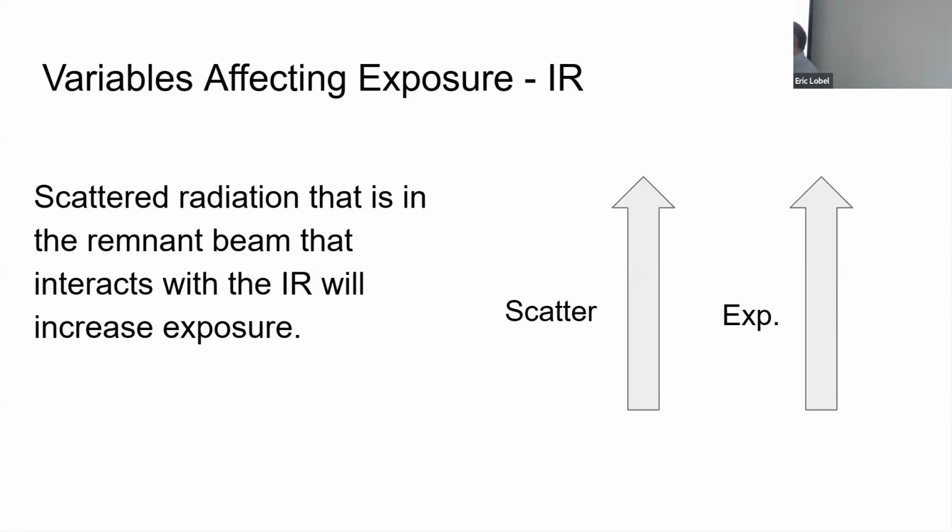And if we can do that without a grid, then we'll save radiation dose to the patient because we're not worried about killing too many good photons, which is why when you use a grid, you have to increase your exposure.